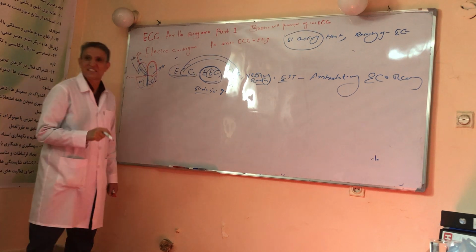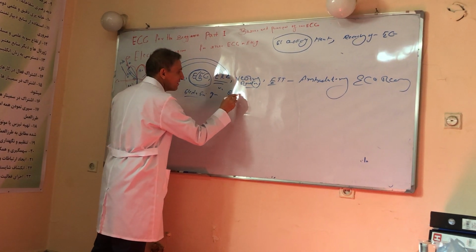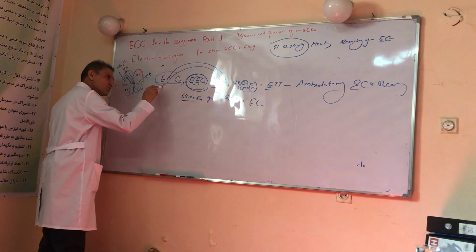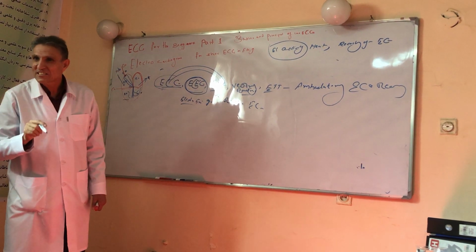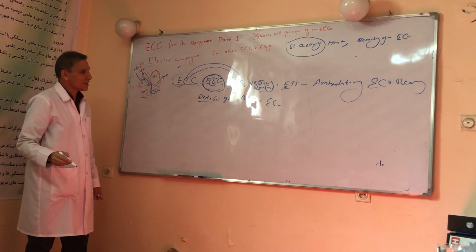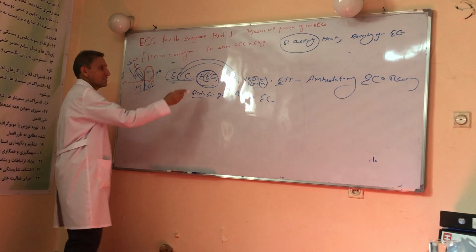But there are some countries that prefer to use EKG rather than ECG, because sometimes EEG could be confused with ECG because of the similar sound or same pronunciation. To prevent this confusion, some countries prefer to use EKG. That is why I discuss this EEG here.